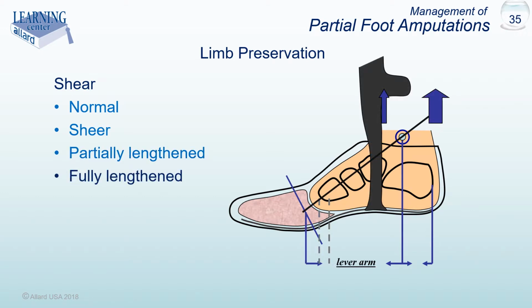The Allard technique is to modify the foot plate to direct forces towards the shoe brake. By adding the additional lever arms of a lateral strut and an anterior shell to the foot plate, we have now effectively lengthened the anterior lever arm and have recreated functional balance. Shearing forces are now being managed and the foot is being protected from those forces.